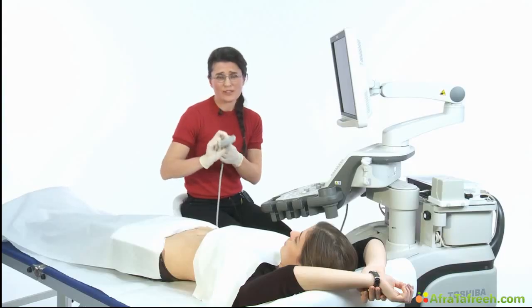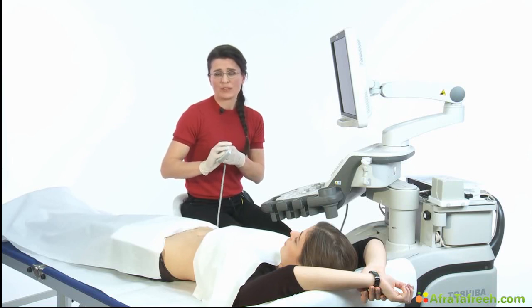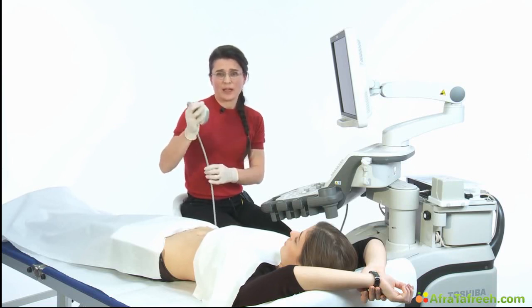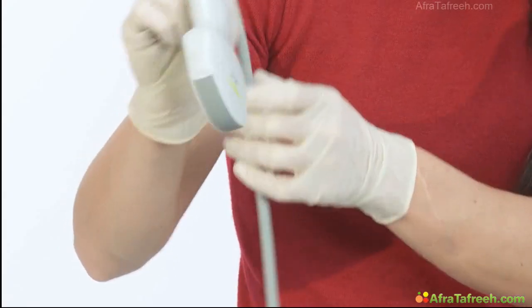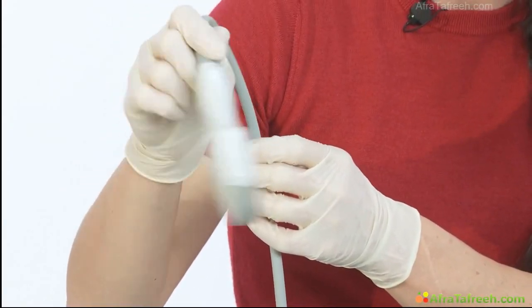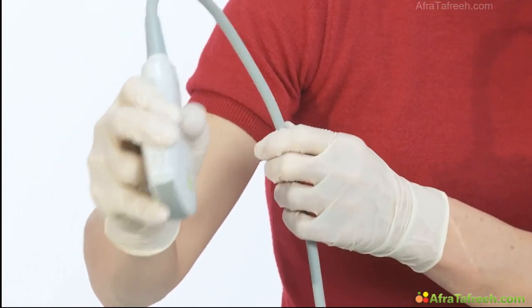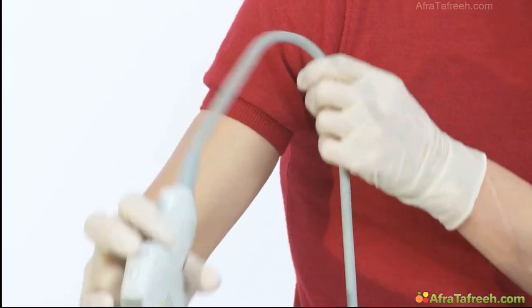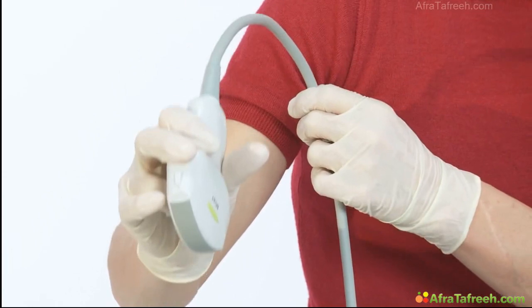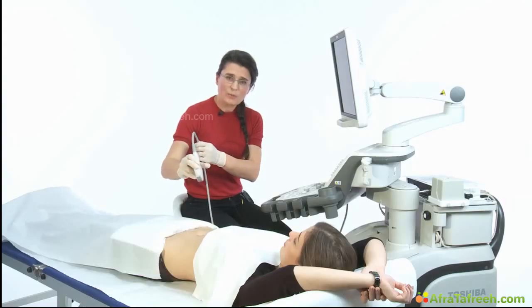Then how to hold the transducer. There are several ways. I just can show you our way. For me, it's important that I got enough stability and have good contact with the body of the patient. So I hold it not too near the cable, because when I hold it in this position, it's quite wobbly. I don't have enough stability. And when I hold it near the nose, I can also have contact with the body of the patient and apply the pressure I need. I hold it like a pencil because I can stabilize it, and it's also light enough that I can do the movements that I need, tilting or moving a transducer.